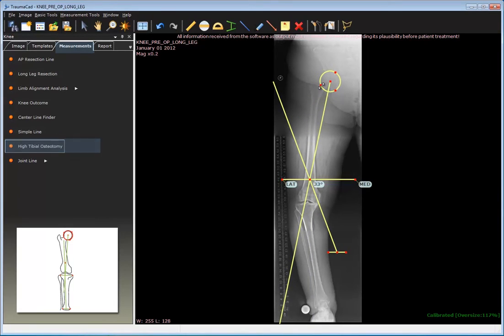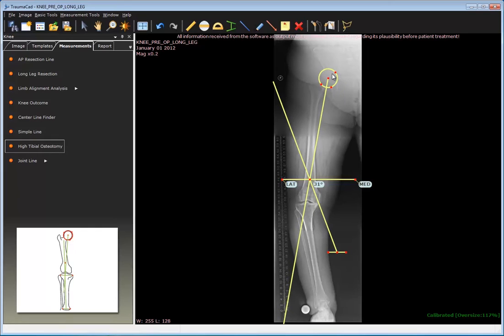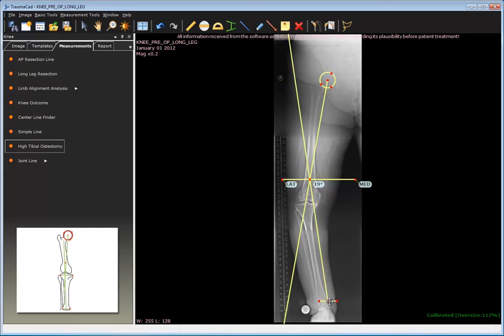First, mark the center of the head by adjusting the three dots at the edges. Then adjust the tibiotalar joint line.